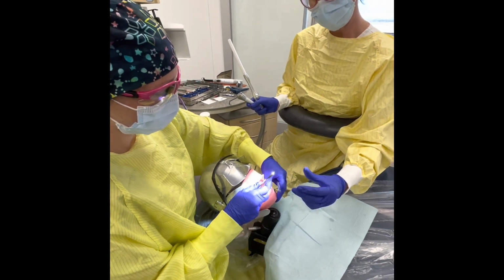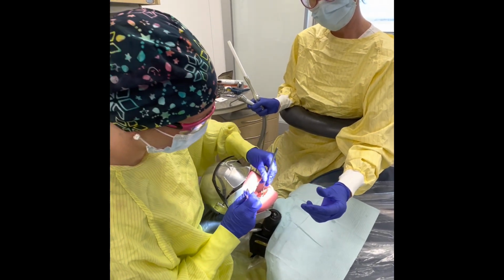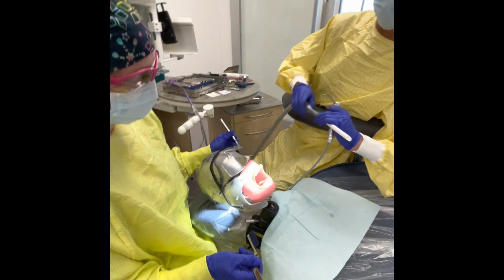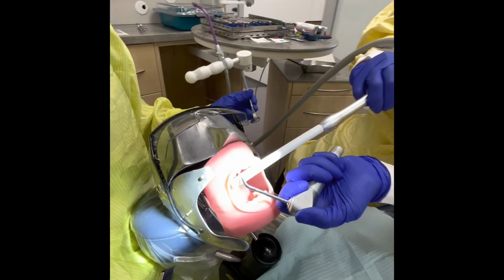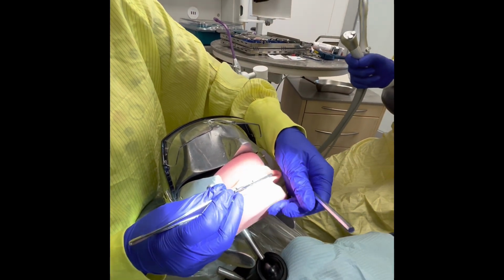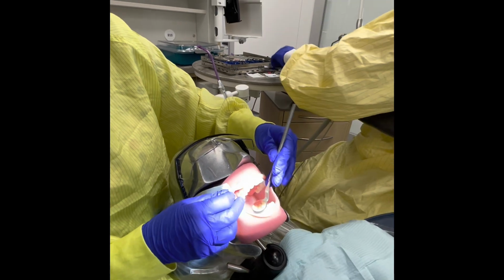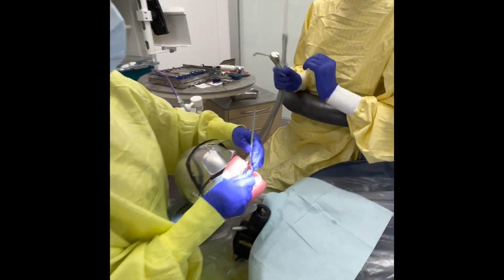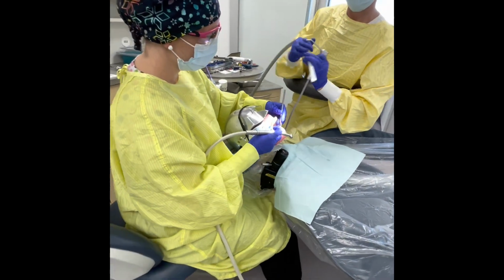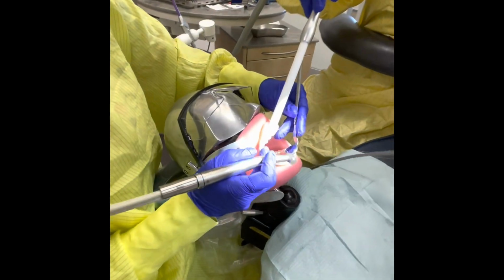How does that look, Amanda? Oh, that looks much better, Stacy. I'll check the anterior now, please. I'm just going to dry that for you. Thank you. And again, I'm going to come in and chomp, chomp, chomp. Pass that to Stacy. Oh, that is high as well. So first thing I'm going to use is my high-speed handpiece with my polishing burr again. So Stacy's going to come in and place her suction.